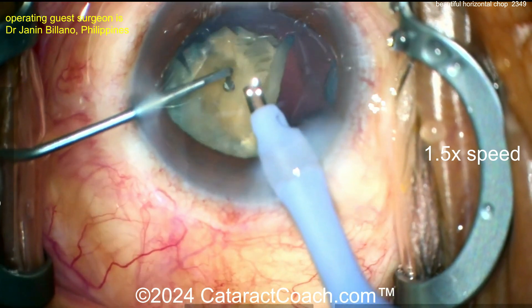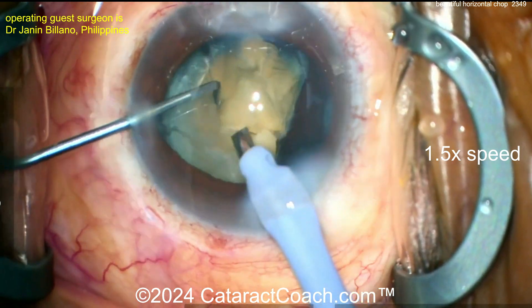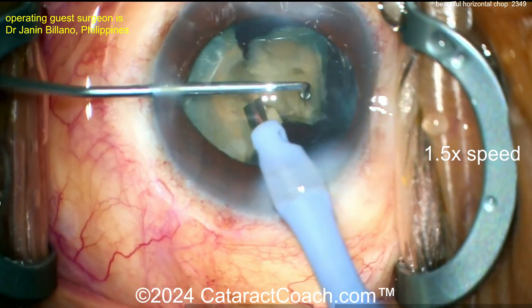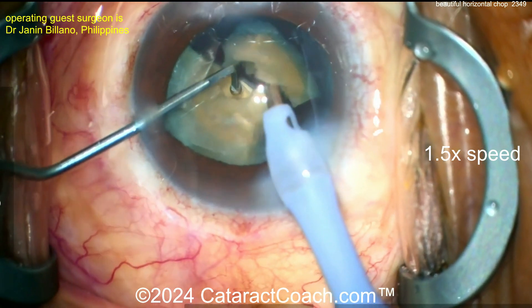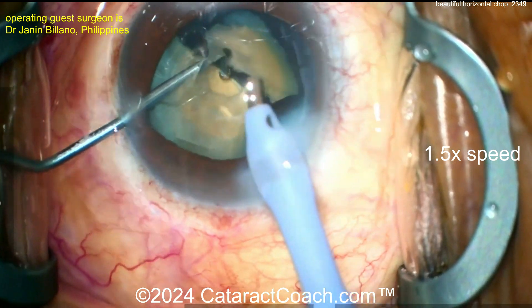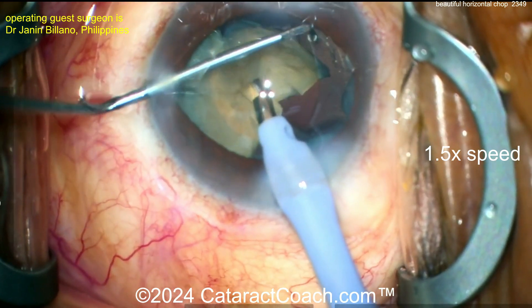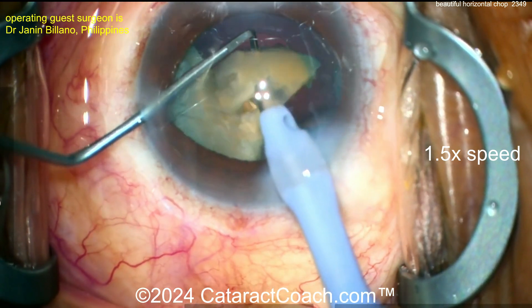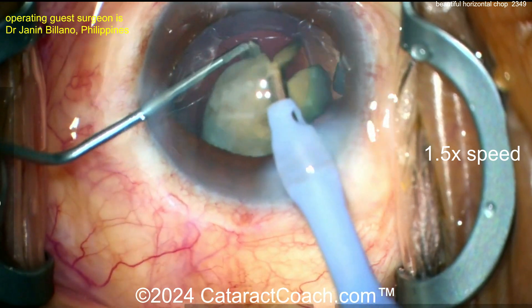Now at this stage you see all these quadrants are kind of attached at the bottom — there's some fibrous nature to that posterior plate. Here's that quadrant piece coming out, and now in the bag is one quadrant remaining. Very nicely done. Try to put the right hand down a little bit towards the floor of the room to isolate a little bit more — there you go — or center up the scope a little bit.